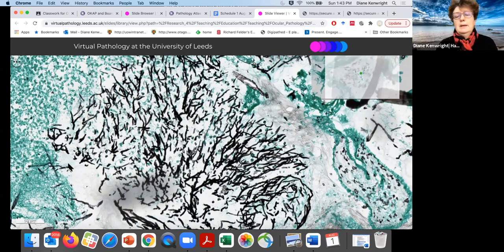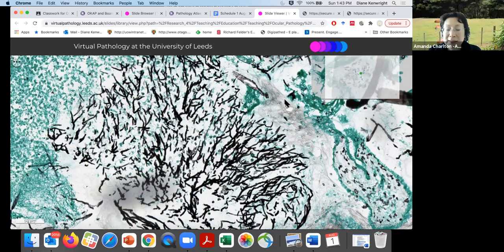What color would they be in a PAS? PAS is various shades of pink, and these would be very dense, dark pink, like in the circles up there. It would be the deep dark pink, whereas the background material would be very light pink. PAS also stains up basement membranes, but if I was doing the PAS for here, I'm not looking for basement membranes. I'm looking for fungal hyphae. It stains there because there are carbohydrates in there.